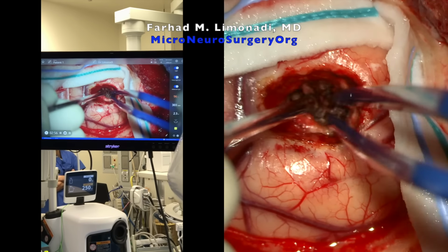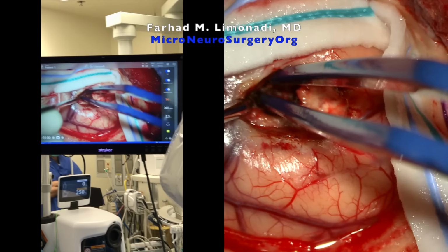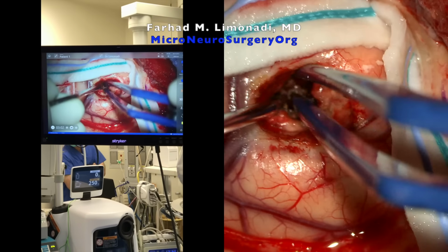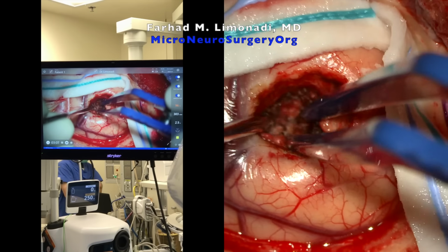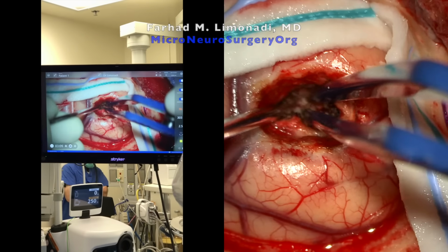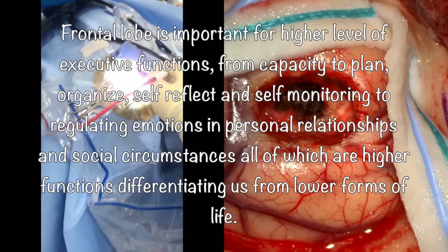Minimal brain swelling, minimal violation of the frontal lobe. And that's the ticket for this surgery. Preserve the frontal lobe, which is everything. To me, absolutely eloquent cortex.